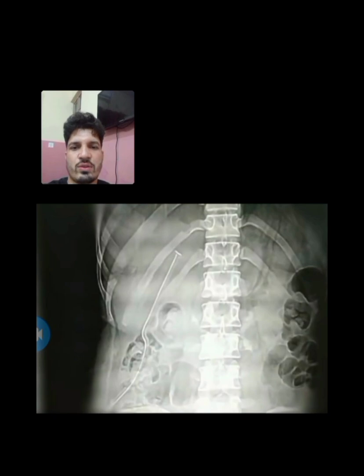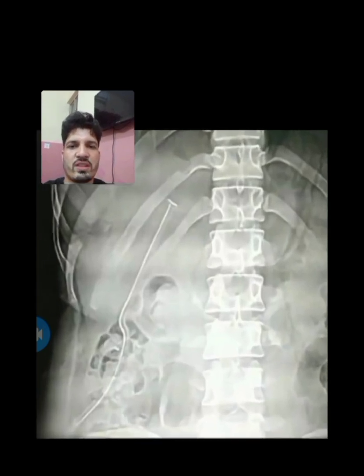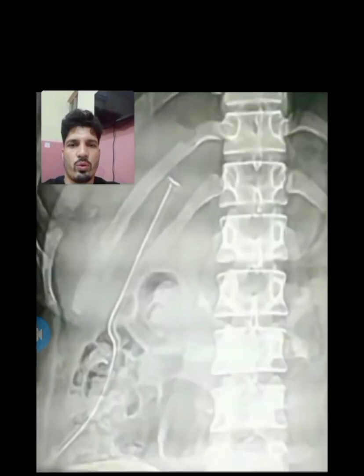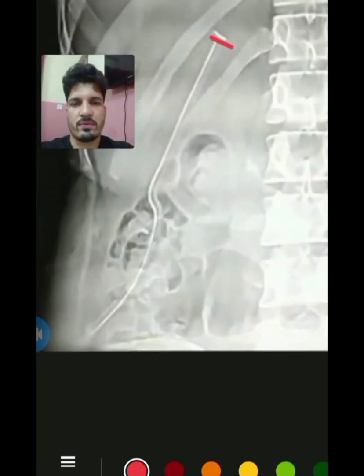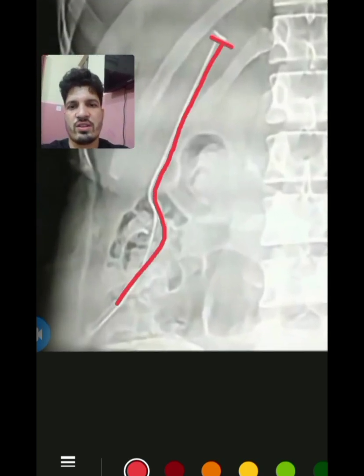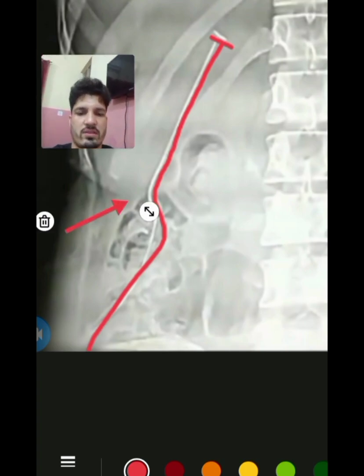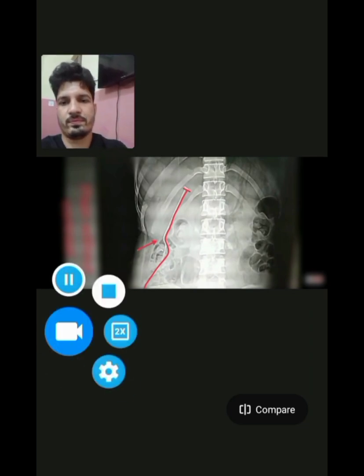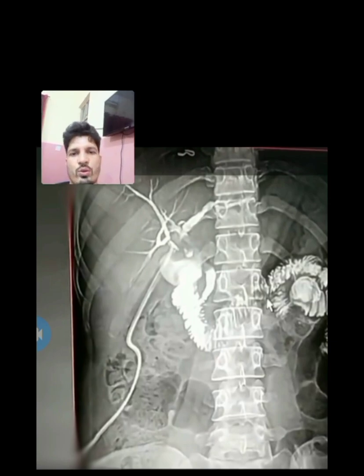First of all, you are seeing on your screen the plain film without contrast — a supine view — and the T-shaped tube is visible on the screen. I am zooming in and marking with a red line this whitish tube. This is the T-tube, and you are clearly seeing it.